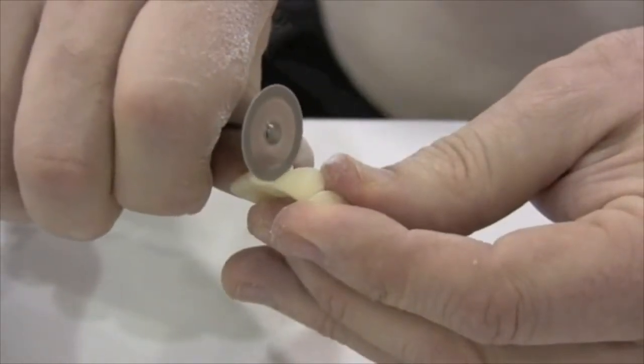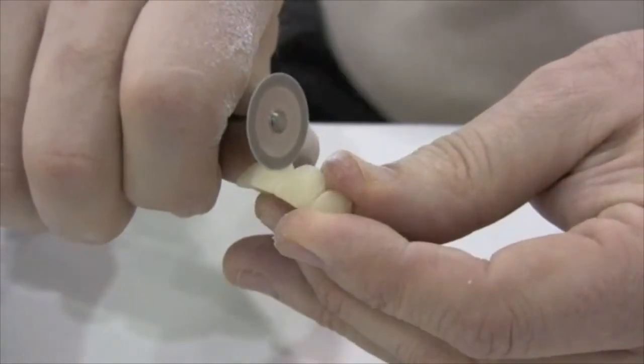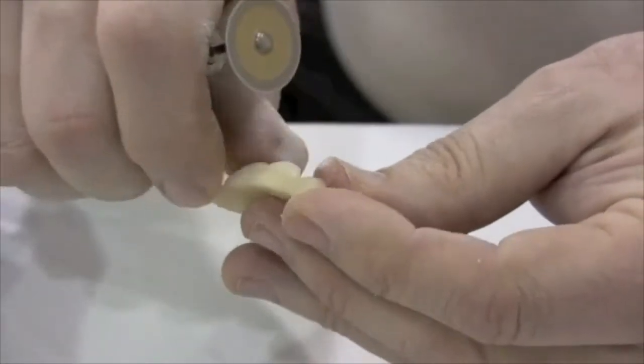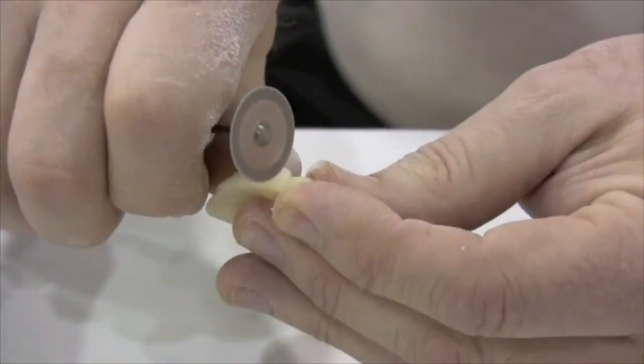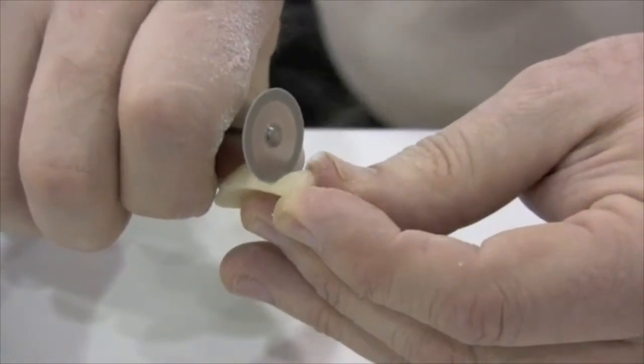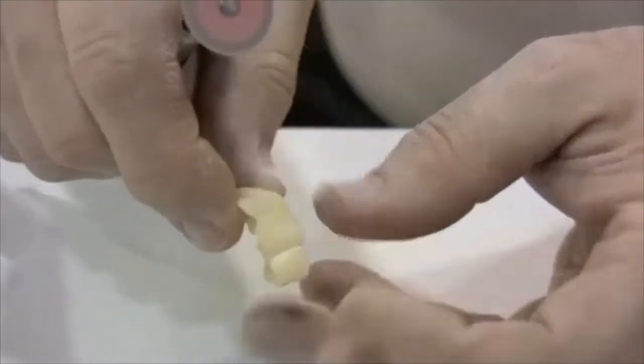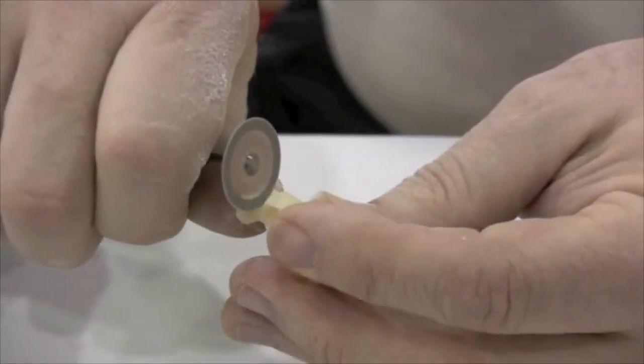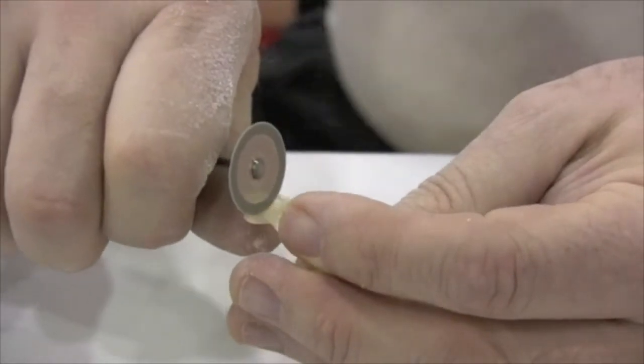Sometimes bisacryls can get a little gooey and sticky when they're in the presence of the heat generated by the burr or handpiece. Again, this material behaves a little bit more like traditional methyl methacrylate in that respect.